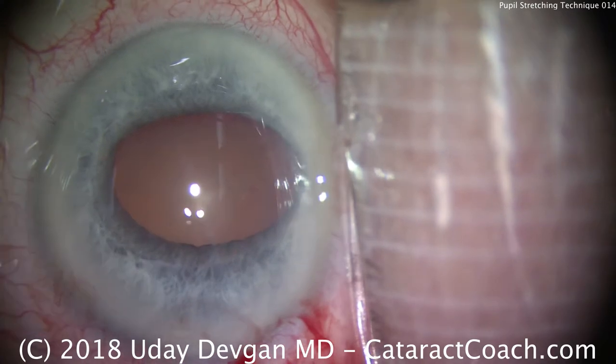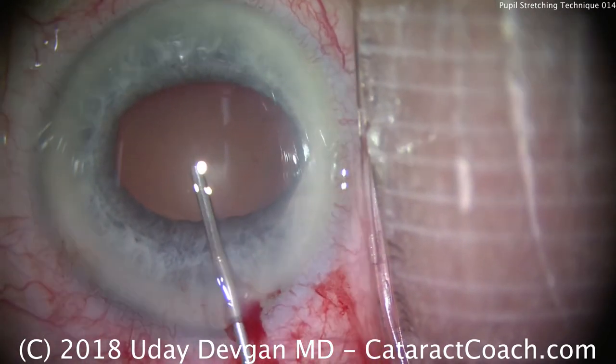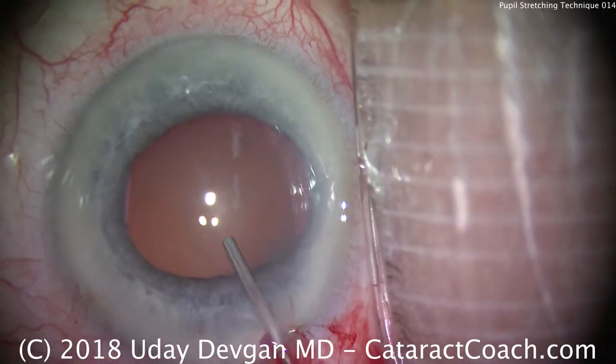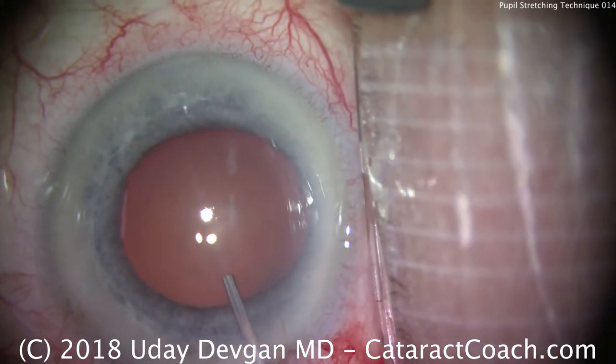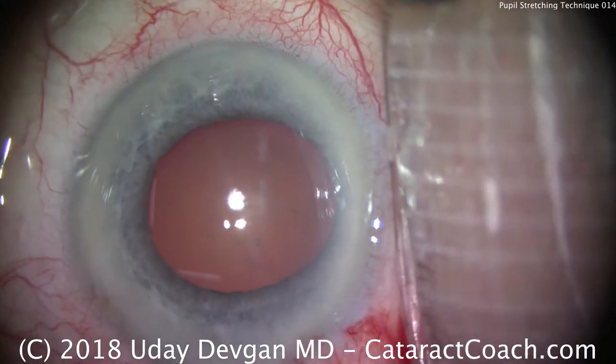Now, instill more viscoelastic to expand the pupil further. We started off at about a 4mm pupil; it's now more like a 6 or even 6.5mm pupil. And that's certainly going to be sufficient for us to proceed with the case.